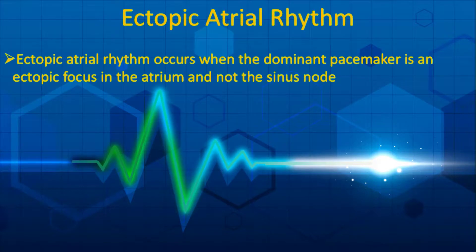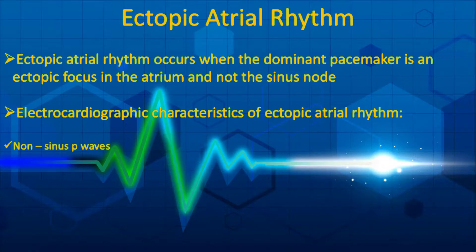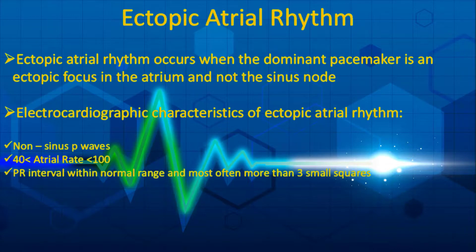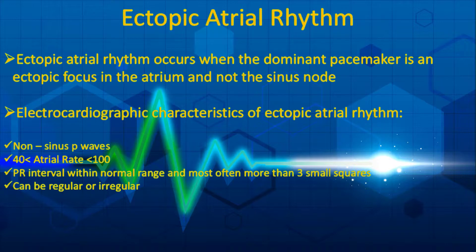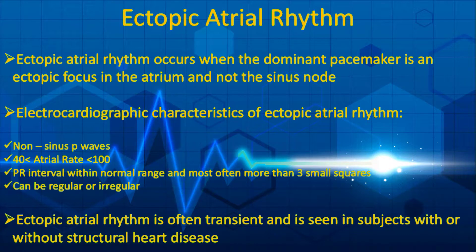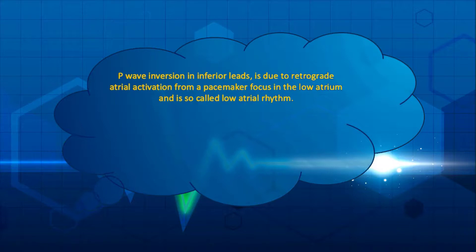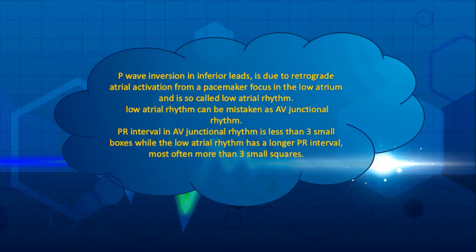Ectopic atrial rhythm occurs when the dominant pacemaker is an ectopic focus in the atrium and not the sinus node. The ECG features are: (1) non-sinus P waves; (2) atrial rate ranging from 40 to 100 beats per minute; (3) PR interval within normal range, most often more than three small squares; and (4) regular or irregular rhythm. Ectopic atrial rhythm is often transient. P wave inversion in inferior leads, as in today's tracing, is due to retrograde atrial activation from a pacemaker focus in the low atrium — called low atrial rhythm. It can be mistaken for AV junctional rhythm; remember that the PR interval in AV junctional rhythm is less than three small boxes, while low atrial rhythm has a longer PR interval, most often more than three small squares.